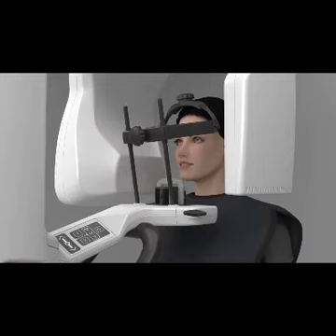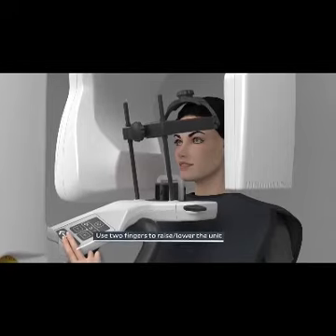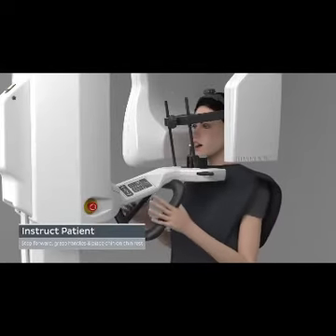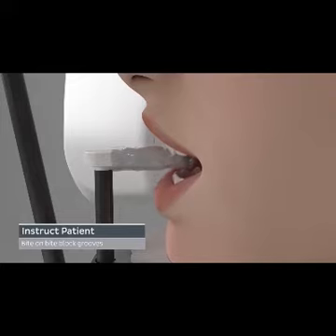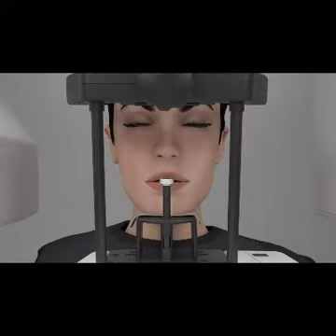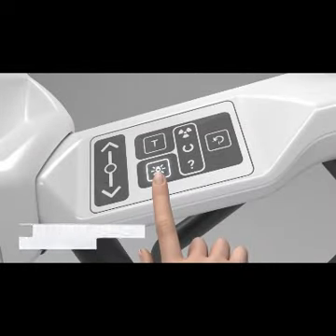Instruct the patient to stand as straight and tall as possible. With the patient standing outside of the unit, raise or lower as needed so the patient's chin is level with the chin rest. Have the patient step forward, asking them to grasp the patient handles and place their chin onto the chin rest and bite on the bite block so that both the upper and lower anterior teeth are in the bite block's grooves. Tell the patient to close their eyes so you can use the alignment lights to properly position them.